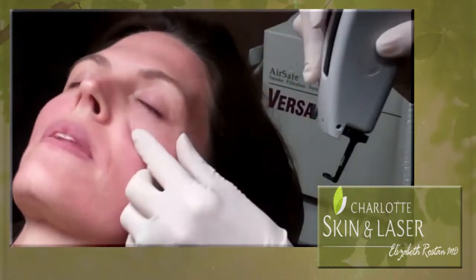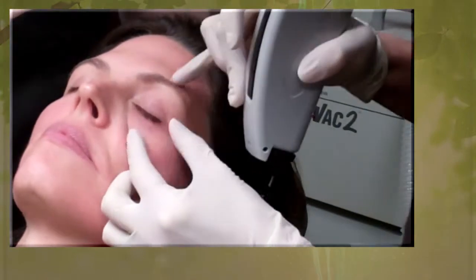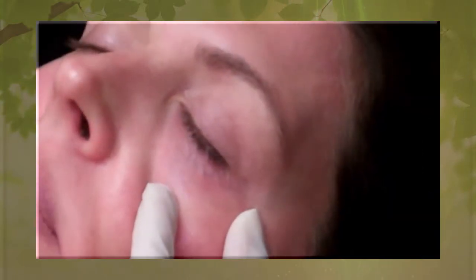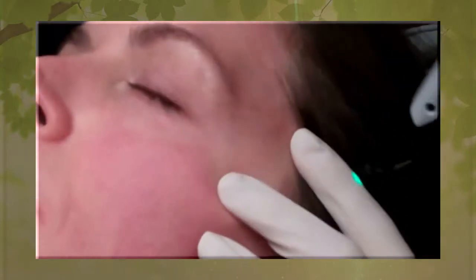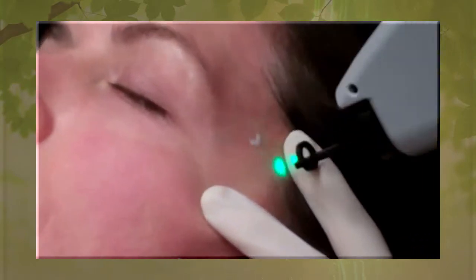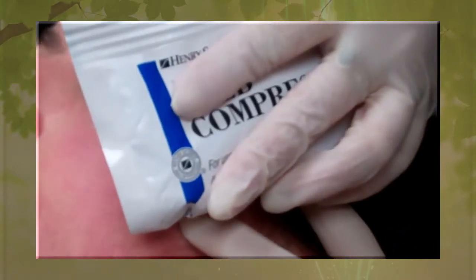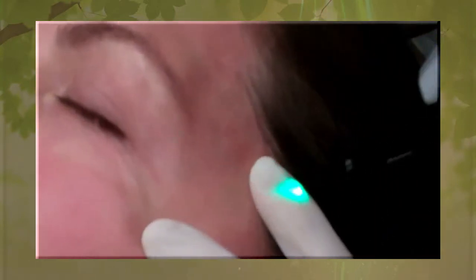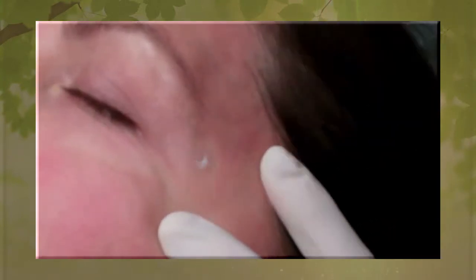We're going to start right underneath here. We see an immediate contraction of the blood vessel — you see it disappear? This is a pretty immediate result.